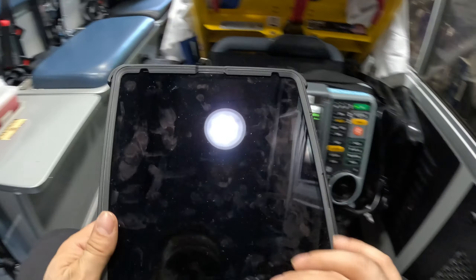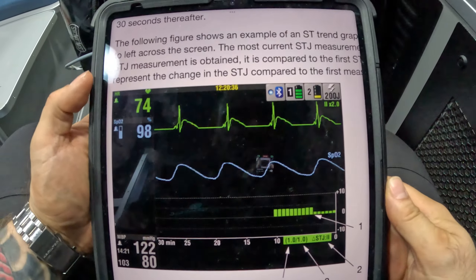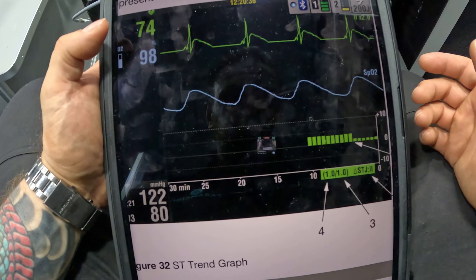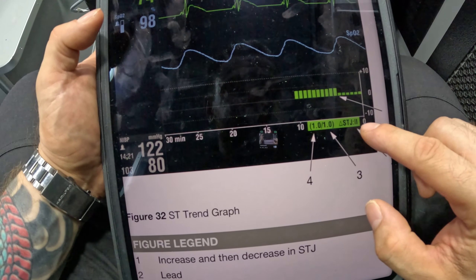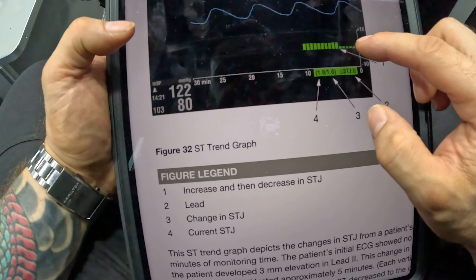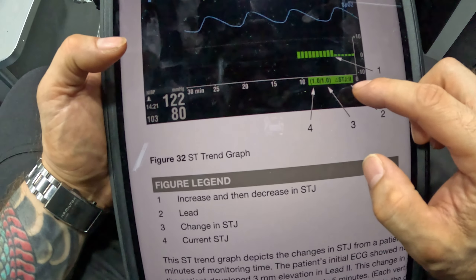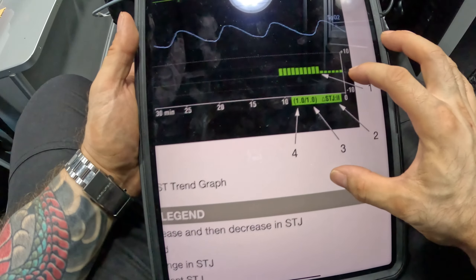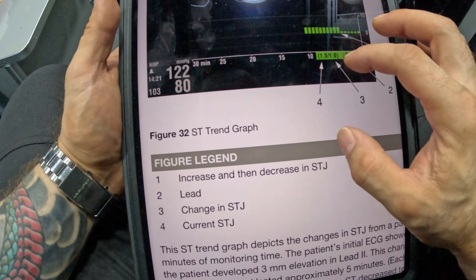Now I'm going to show you on this LifePak 15 — this is essentially from the manual — how it would look if there were any differences. So it will, every 30 seconds, essentially read all 12 leads and look for the biggest deviation. Here we said it's looking at V2. On this particular diagram it was looking at lead 2, not V2. Figure one corresponds to increase and decrease in ST segment — the J-point right here. Number two is the lead that it's monitoring — in this diagram it's lead 2, for our patient we're monitoring V2. And 3 and 4: 3 is change in ST segment deviation and 4 is his current ST segment that he has.